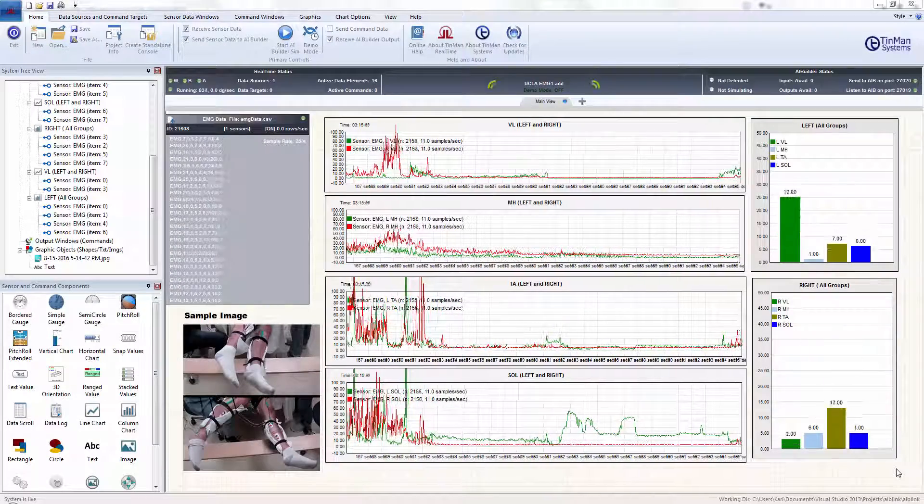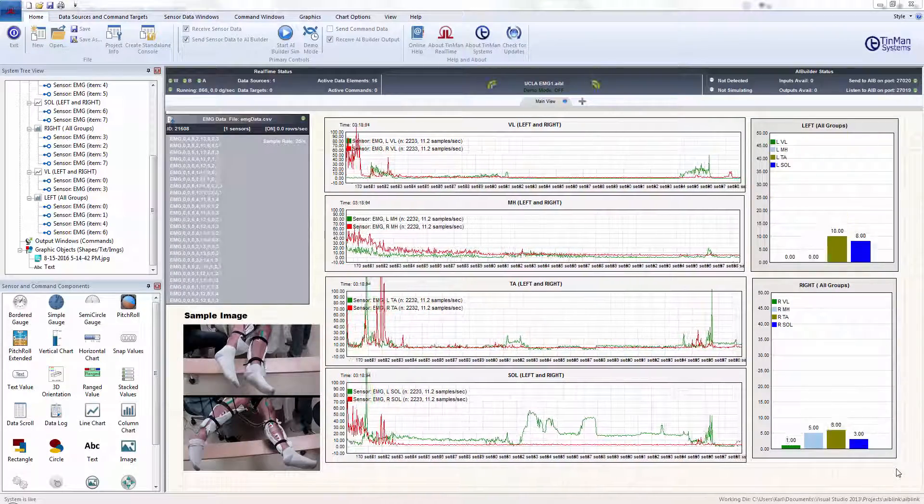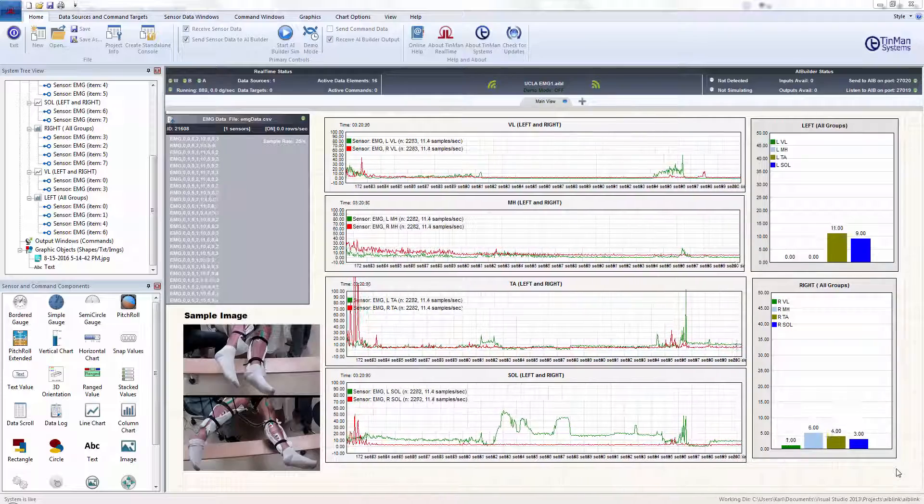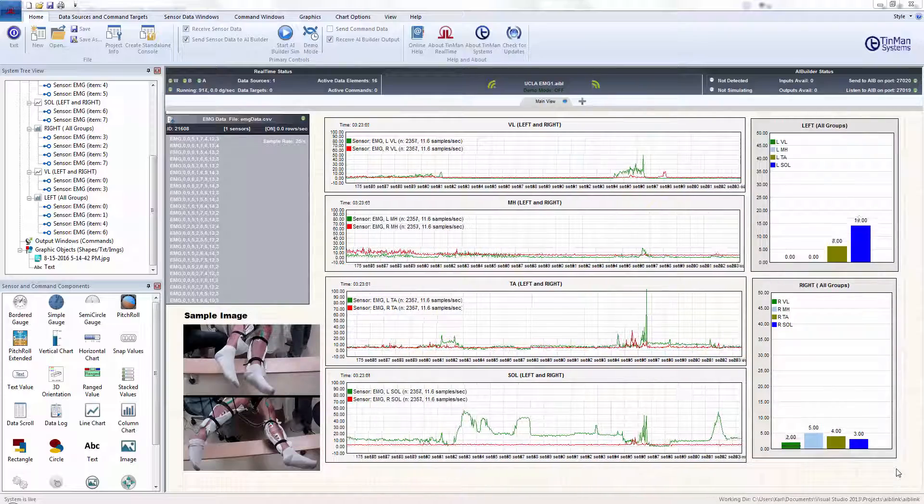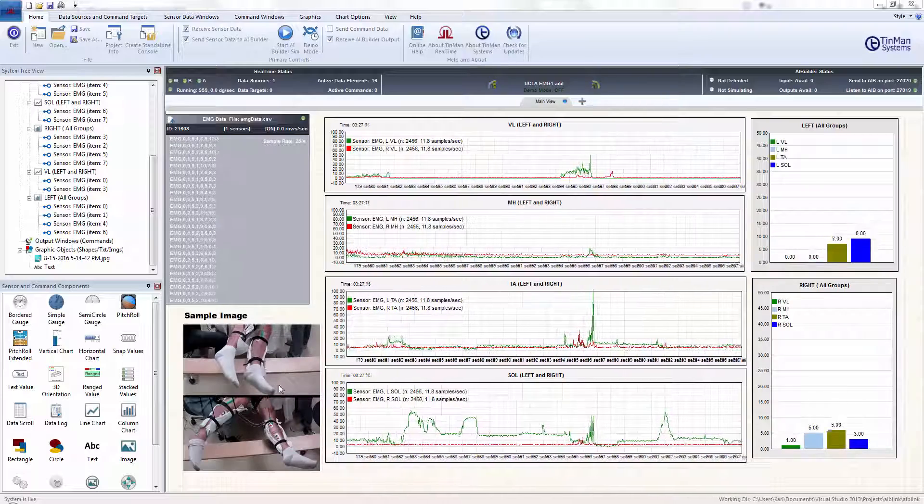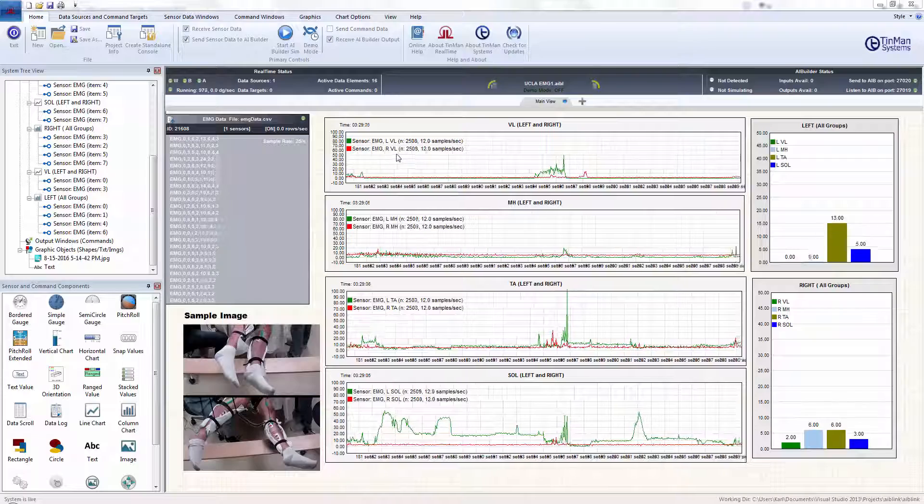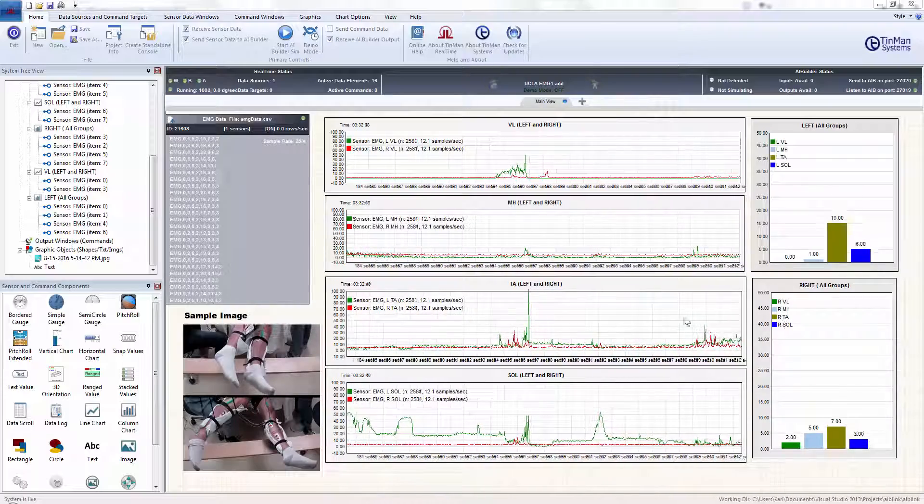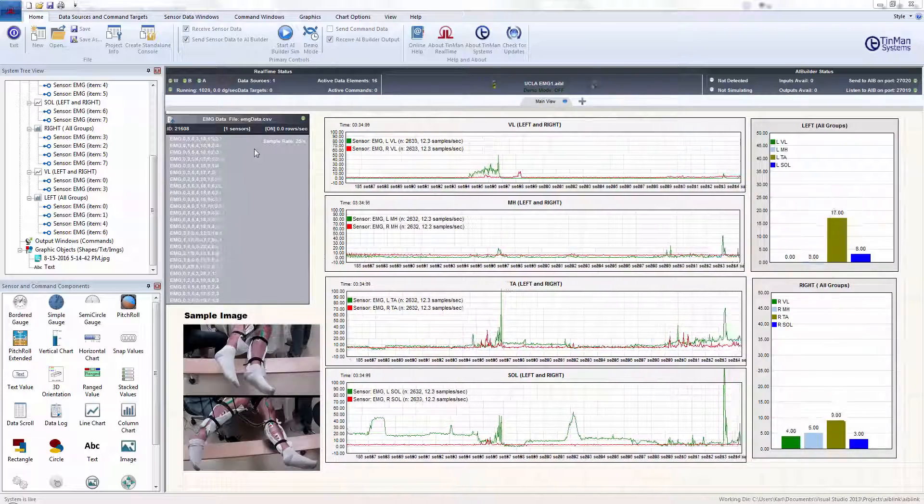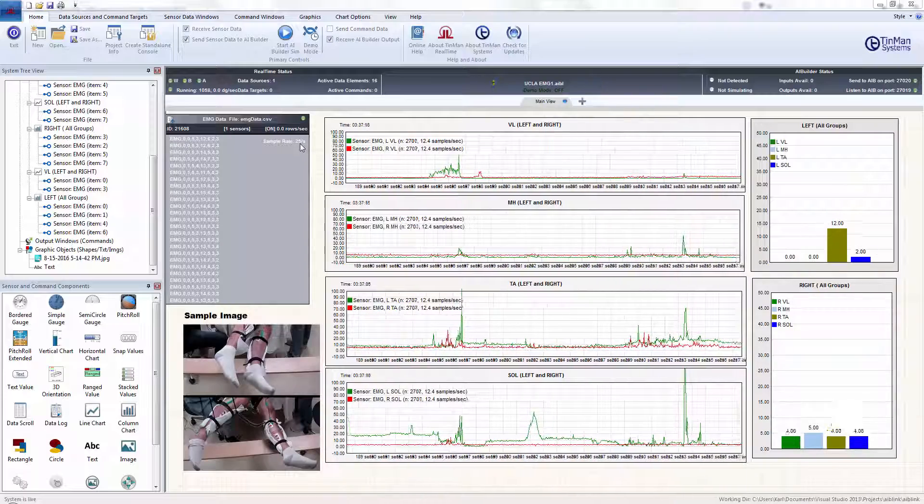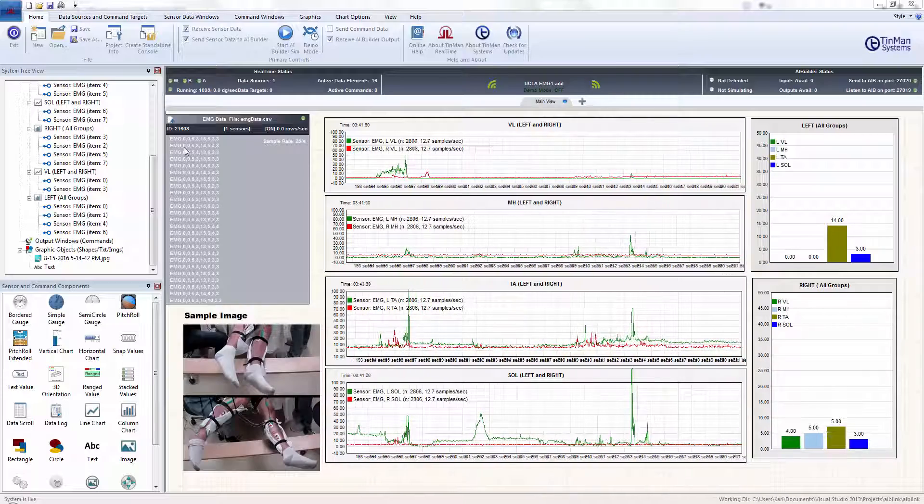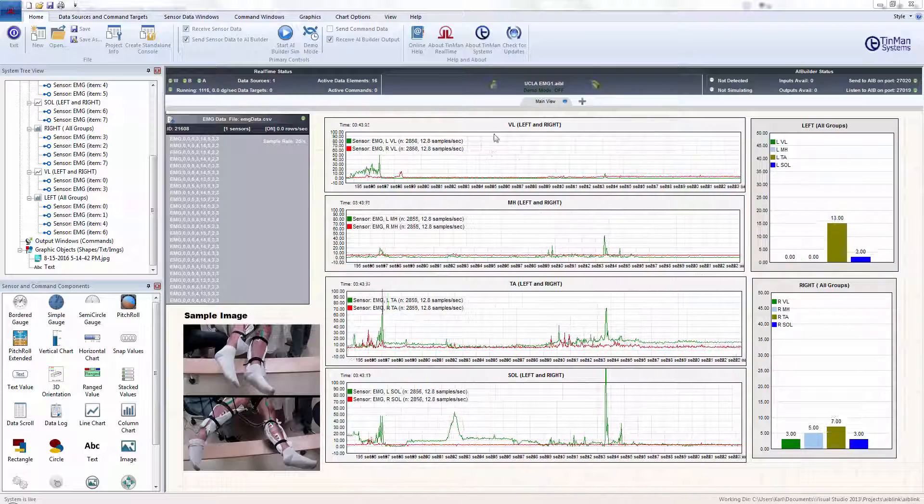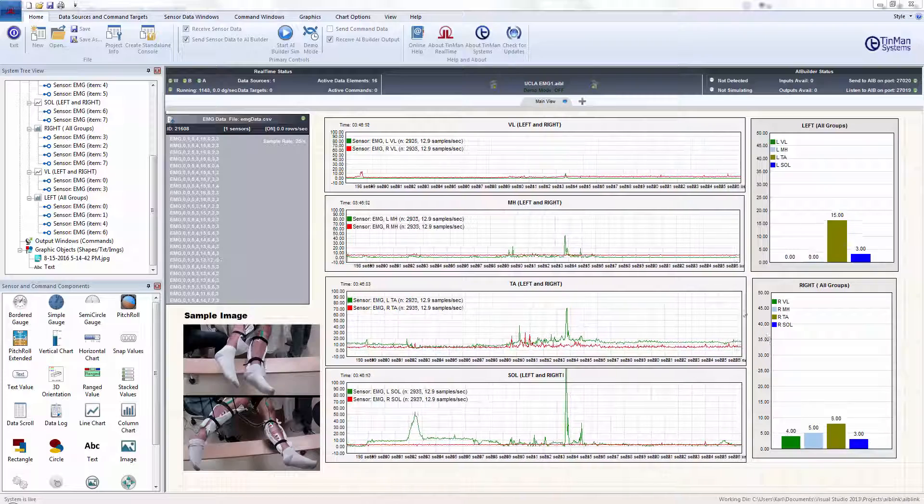Okay, so we brought in some data. This is your EMG data with eight columns of data. I just have a sample image here that I pulled off your website, the UCLA website. And I have six charts. You can see the data flowing in. I've got the sample rate of 25 samples per second and put a parser in here so that we're peeling off the microvolt readings for each of the eight sensors.